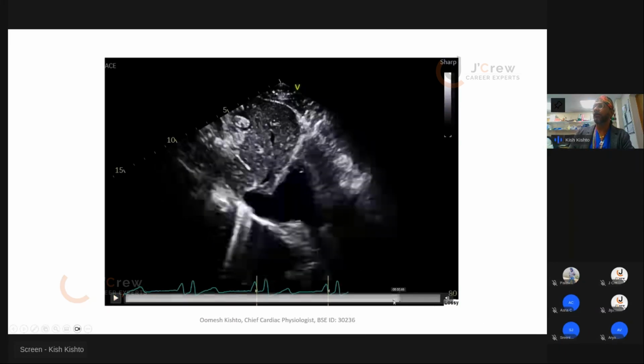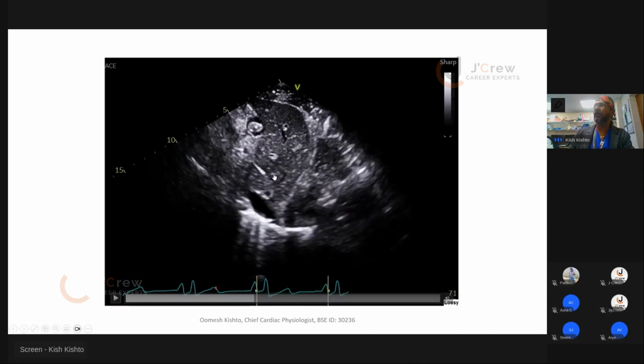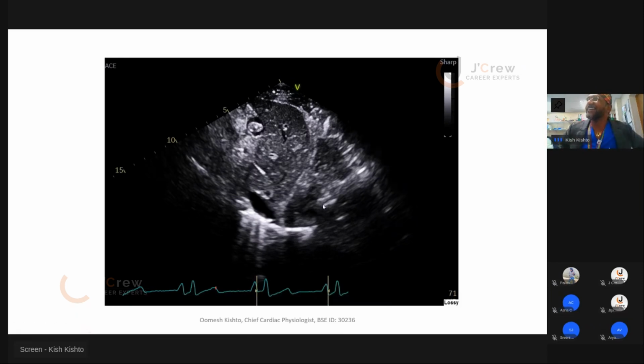I don't know about you guys, but can you all see this liver with the 2 eyes and a mouth and the nose there? Sorry, it's just me being silly, but yeah. So, all right. Any question on MR, please?